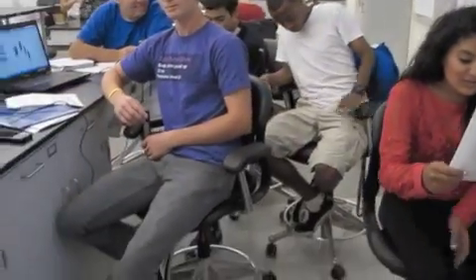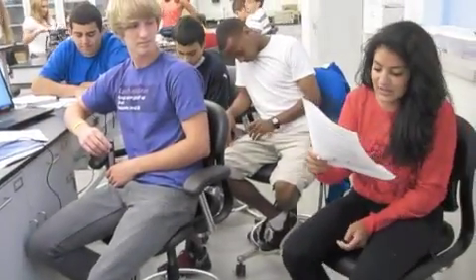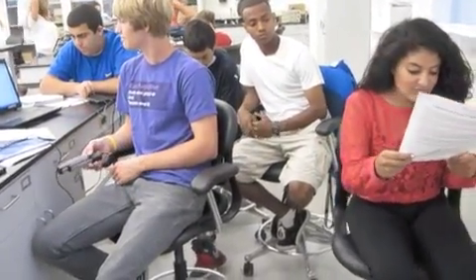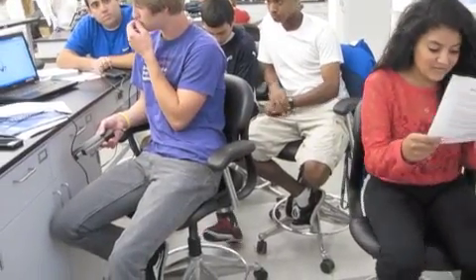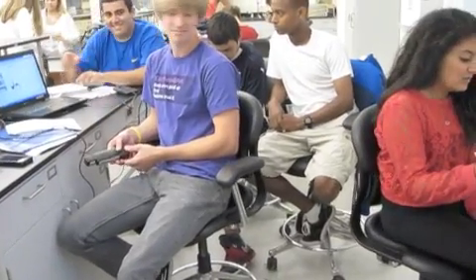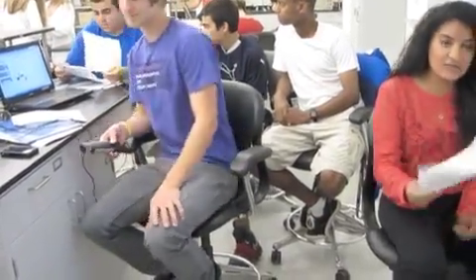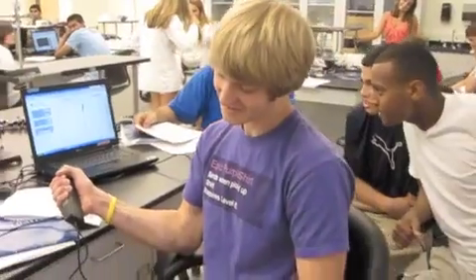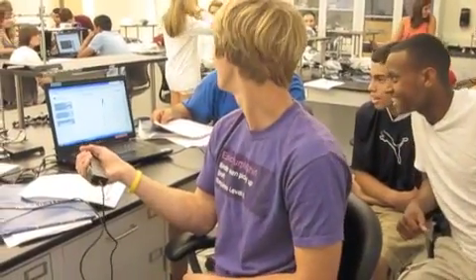If you want to change it up, you can have the person not look at the screen or cheer them on. Along with this lab we just did, we're going to demonstrate the second lab, which is called muscle fatigue, where we will cheer on Bruce and then have him not look at the screen. Once you are done, you will see that there's a difference between the data. So we're going to cheer him on right now. Go, Bruce, come on, do it. Oh, come on. Come on. You guys are pretty bad at cheering.